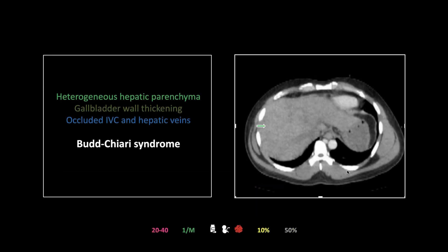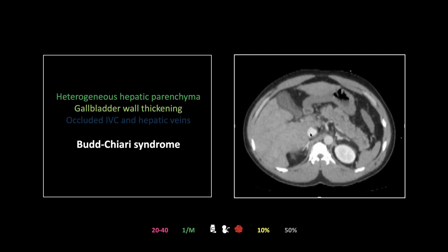The first finding is heterogeneity of the hepatic parenchyma — a perfusion heterogeneity. The IVC and hepatic veins are not filling in a contrast phase where you would in fact expect them to fill. On this cut you can tell because the azygous vein is filling, and for the azygous to fill with the IVC not filling, there's got to be a problem lower down. You can also see gallbladder wall thickening — Budd-Chiari is on the list of causes of gallbladder wall thickening.